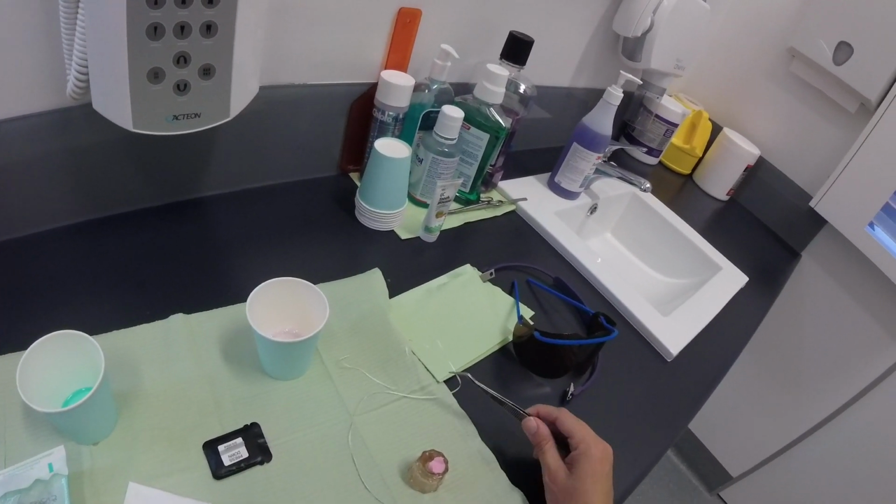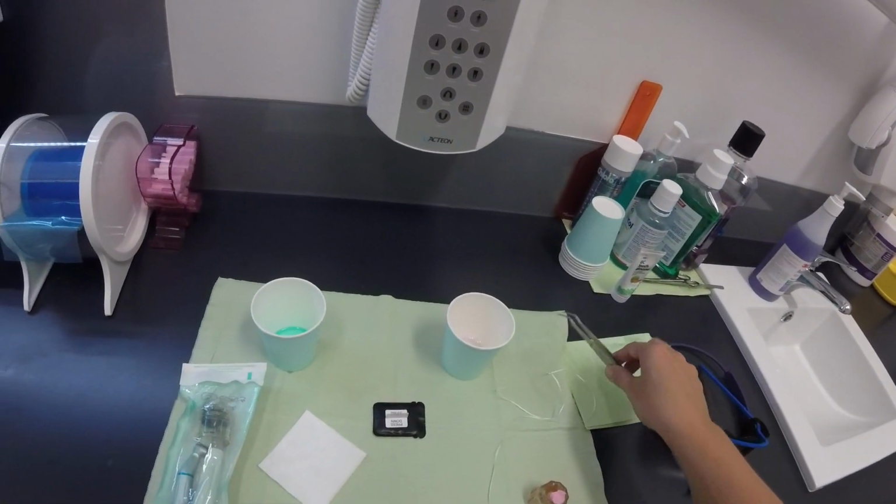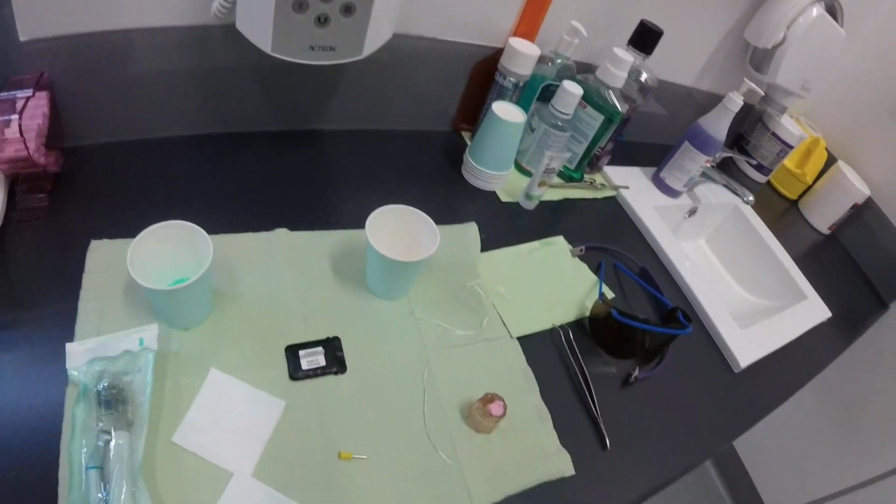Sometimes they get the nurses to do it. Just depends on your practice. So we've also got some mouthwash here. So we give that to the patient. We put it on the patient's side.